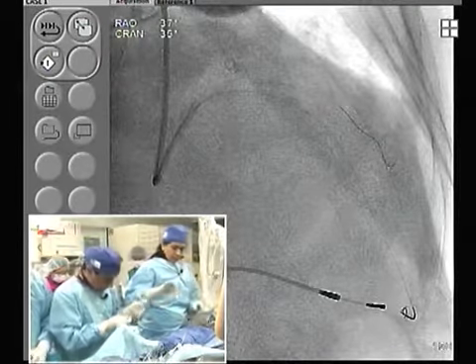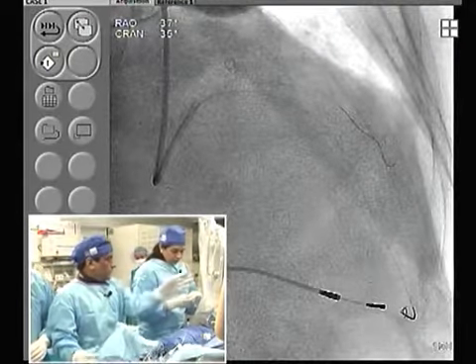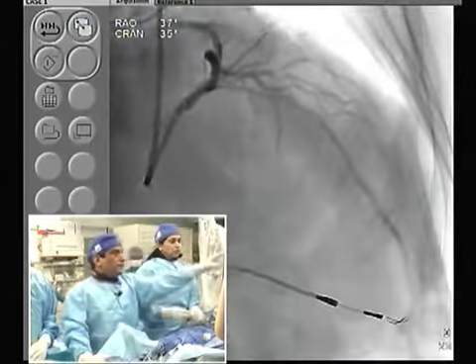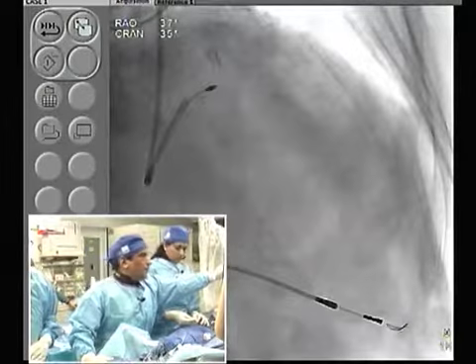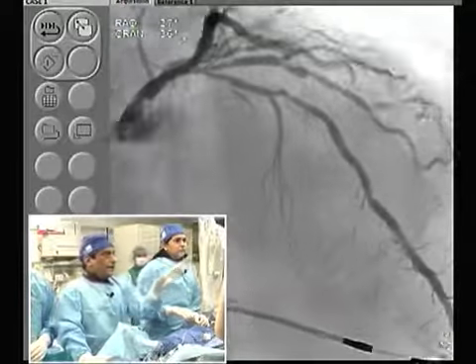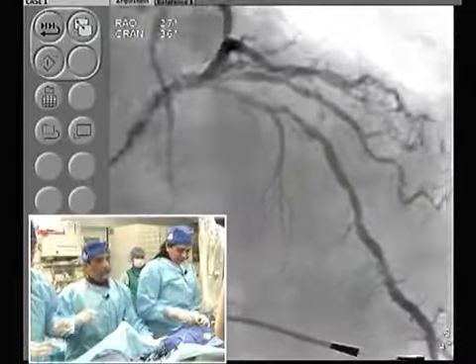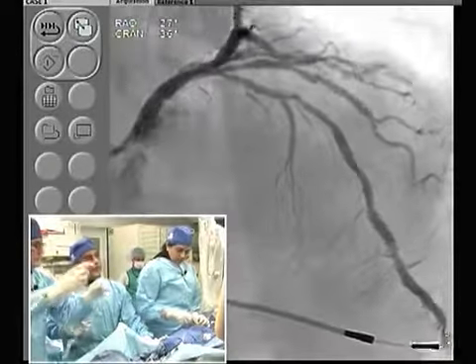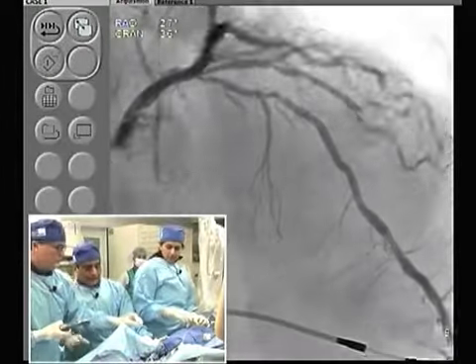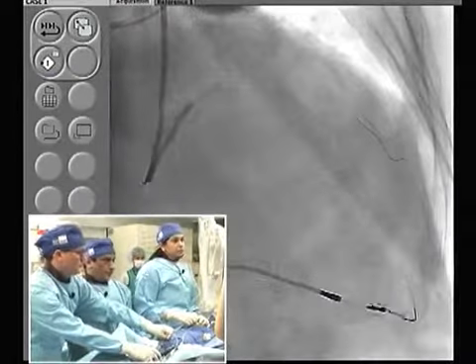The diagonal is plus minus, and this is the point I wanted to make about the focal lesion. We see the diagonal as just a moderate lesion, particularly the ostium. If we do the FFR of the diagonal, I won't be surprised if it is 0.9. But even if it is 0.9, because we are going to crack the lesion there will be a plaque shift. So our strategy is that we are going to take care of this large diagonal with balloon and stent.